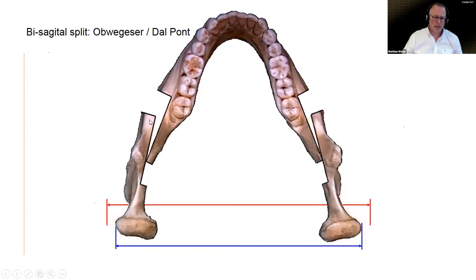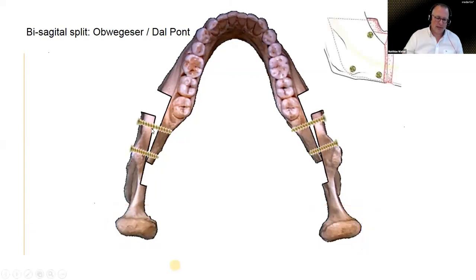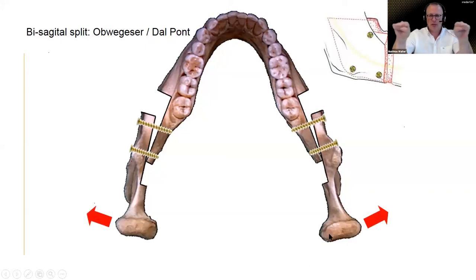So therefore you have to somehow angle now those joint bearing parts. Now there are the classical methods with those screws. This is a very rigid kind of system. So therefore you have to be very careful before you insert those screws, in order to recreate the position of your two condyles relative to one another. If they're slightly off, then your patient sort of experiences some kind of subluxation. They're very painful and so forth. And that's not what we want.